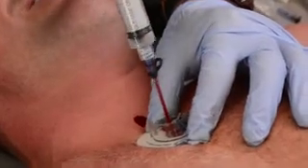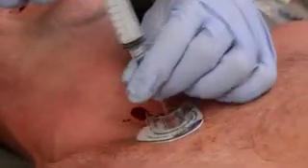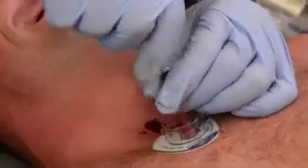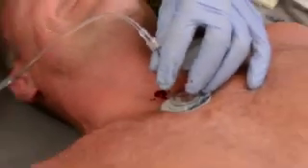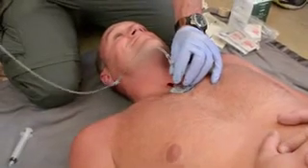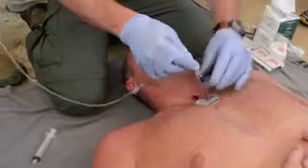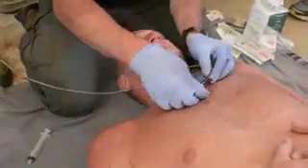During aspiration and flush, patients sometimes remark of a low level of discomfort in the form of a quick visceral pinch. Once aspirated, the IV tubing and bag are connected to the infusion tube and the flow begins immediately. On a pain scale from 1 to 10, the patient claimed he felt only minor discomfort on a level of 3 or 4 for a second or two.